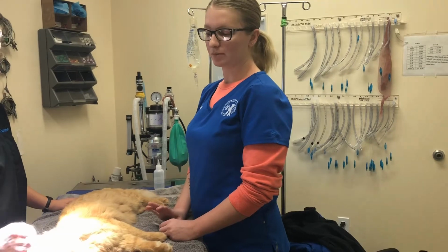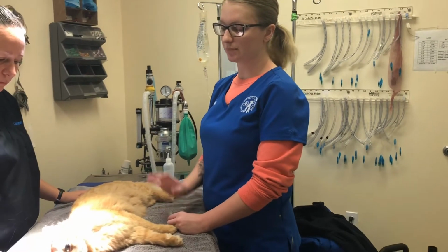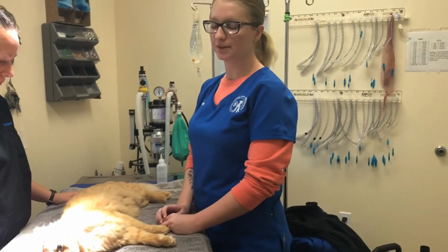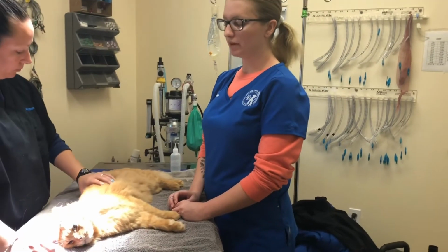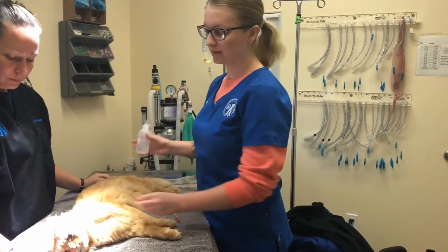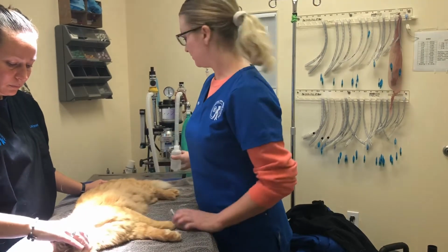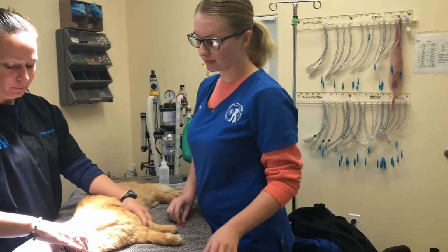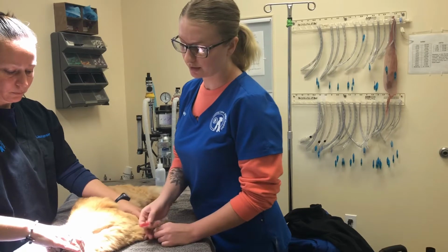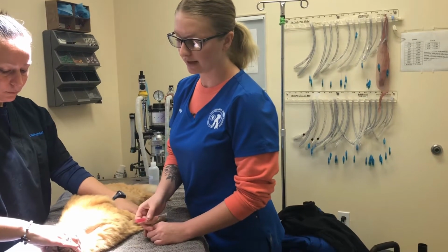Okay, now I will be demonstrating how to perform a jugular blood draw on a feline patient. This is our patient. He's been sedated for this procedure. I've already shaved a window here so that I can help visualize the vein better, but the next step is to prep the area with a little bit of rubbing alcohol. That will help sterilize my site, but will also help me visualize the vein better. I have a restrainer too to help hold the head out of the way.